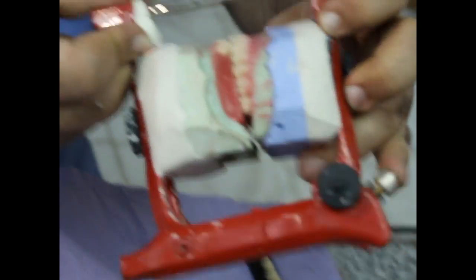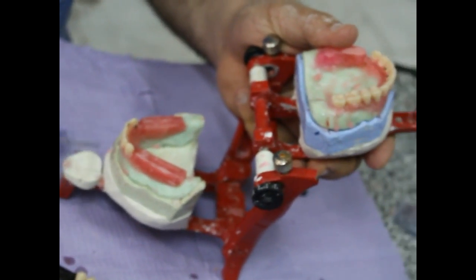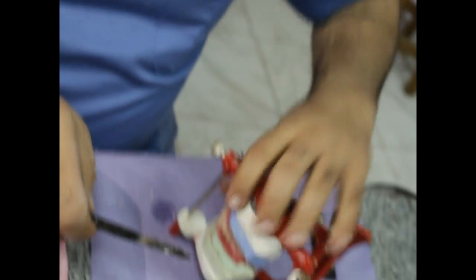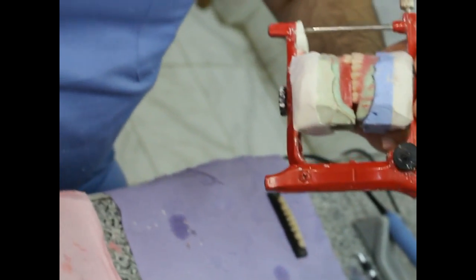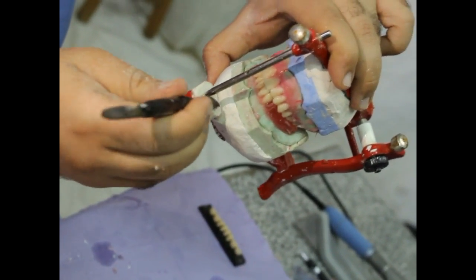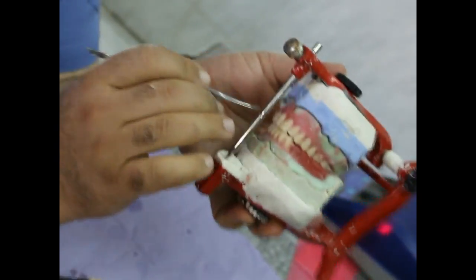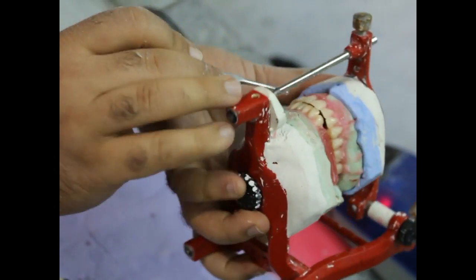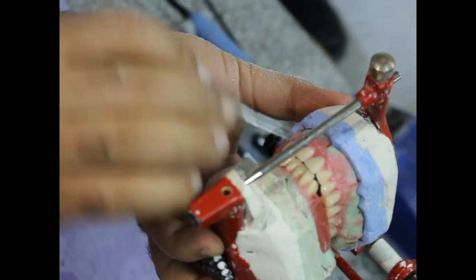As you can see, we have created what we call a compensatory curve. You may find at this stage that the incisal pin is not touching the incisal table anymore, as the inclinations we created in the upper teeth are preventing its complete seating. Remove a layer from the lower occlusal block of these teeth to ensure that the incisal pin is touching properly. We can see now that we have an aesthetically pleasing setup anteriorly — the amount of horizontal overjet equals the amount of vertical overlap or even more.